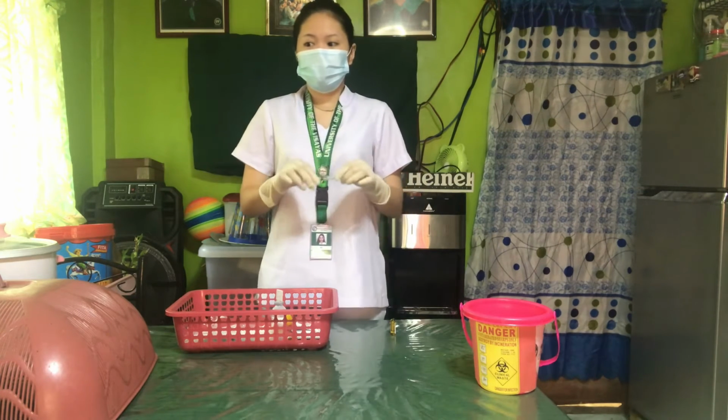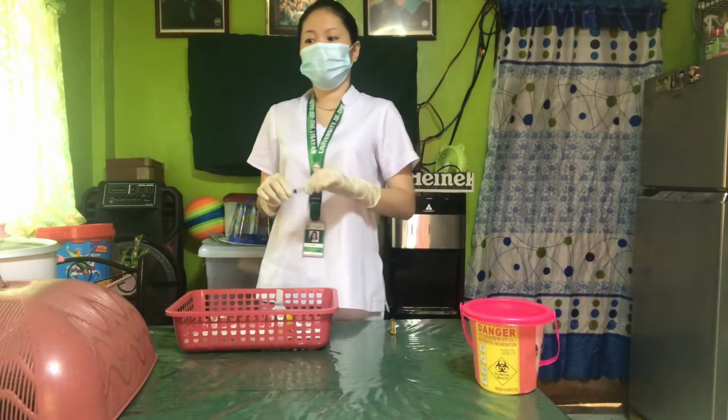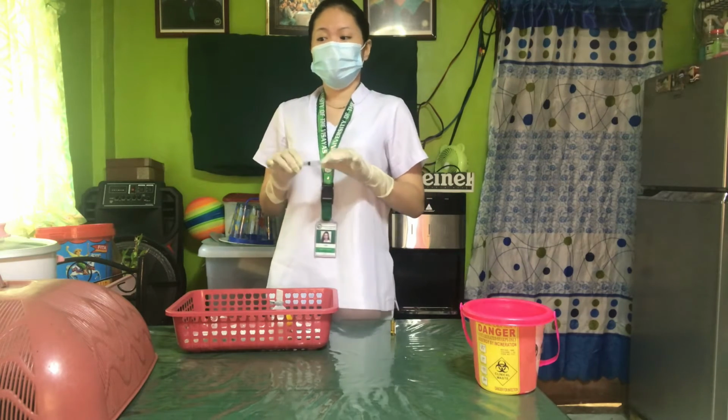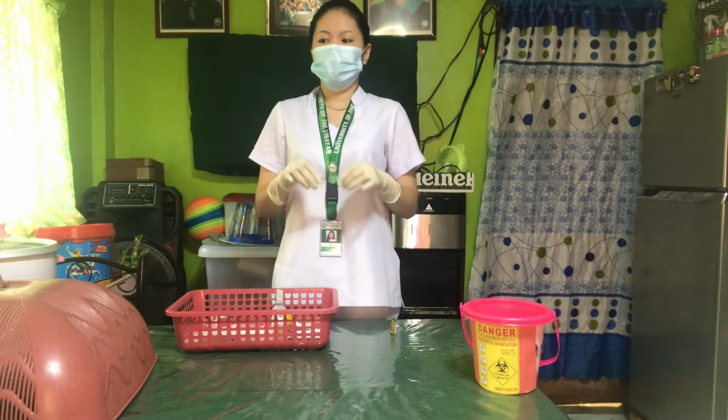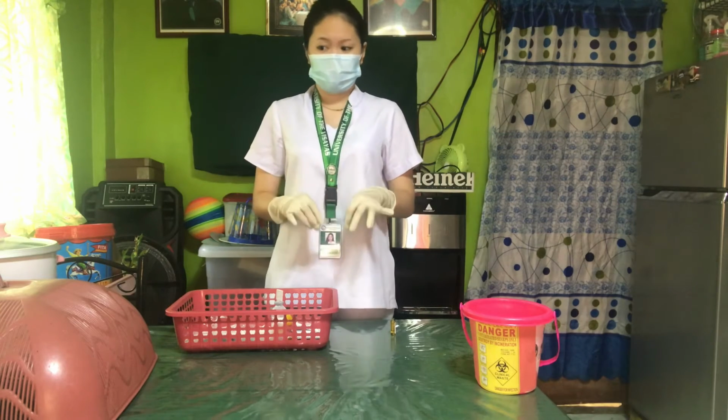We tighten up the cap at the hub of the needle and push the medication into the needle to the prescribed amount. To remove residue from the needle, change the needles after preparation and before administration.